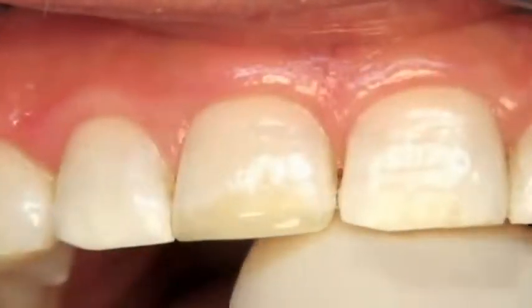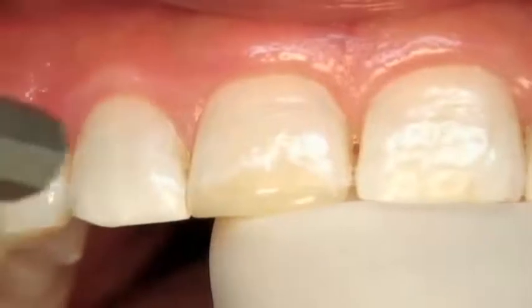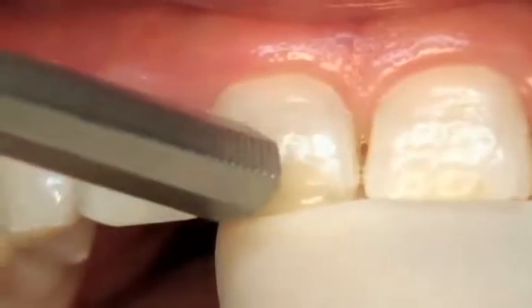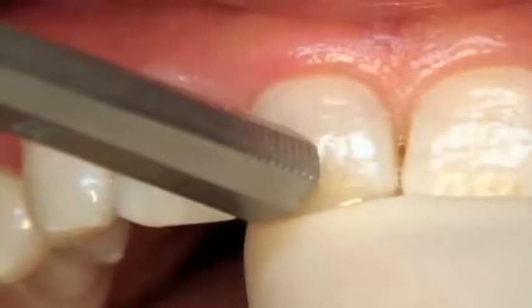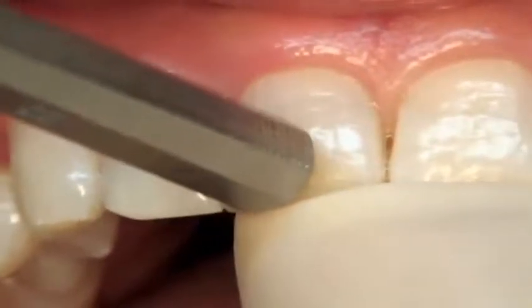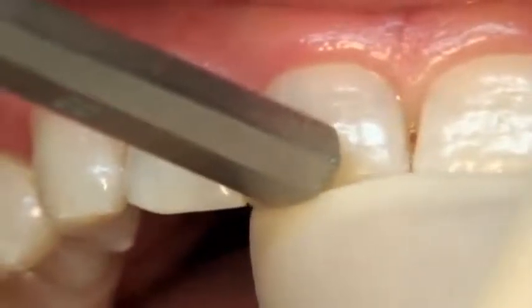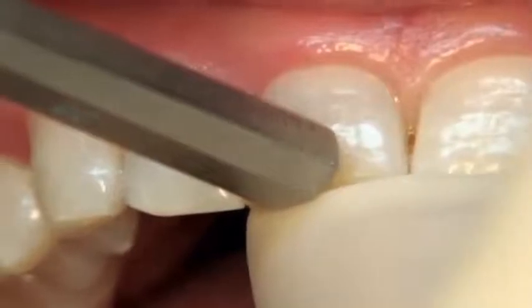Mobility. To determine mobility, place the index finger on the lingual aspect of the suspected tooth and apply pressure with the mirror handle on the opposite facial surface. Movement of more than 2 to 3 millimeters or depression indicates that the tooth is a poor candidate for root canal treatment.